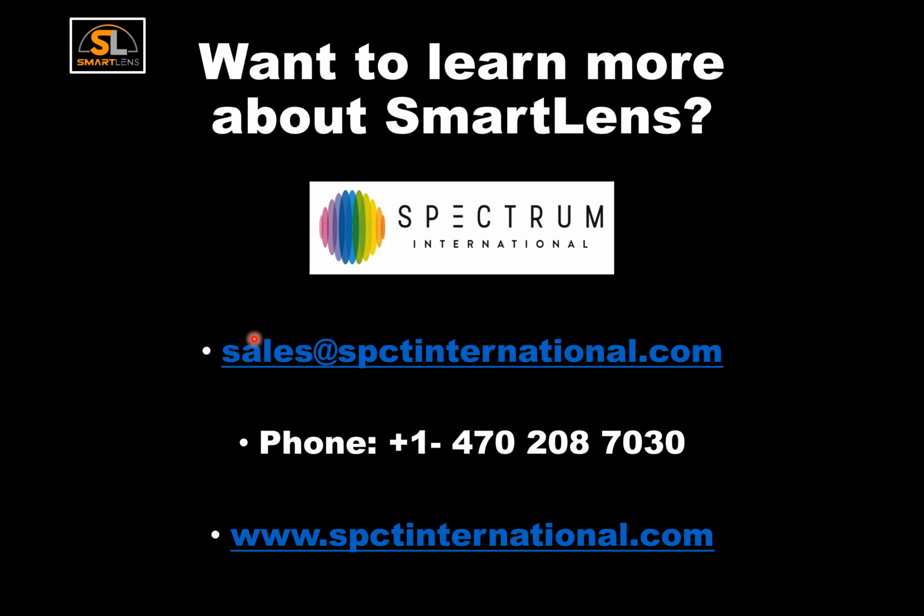Now, if you don't have the ability to measure the pupil size, then of course we can begin with the first custom order having a medium, a large, and a small diameter aperture of that add. So in a worst case scenario, small, medium, and large is fine. And ideally, if you can measure the pupil size in normal illumination, that would be the best way to start.